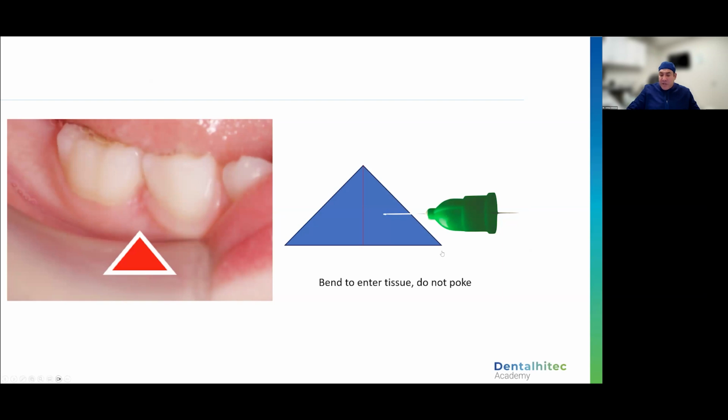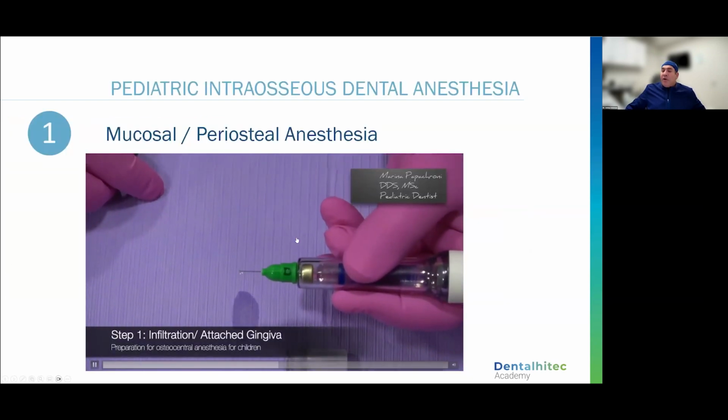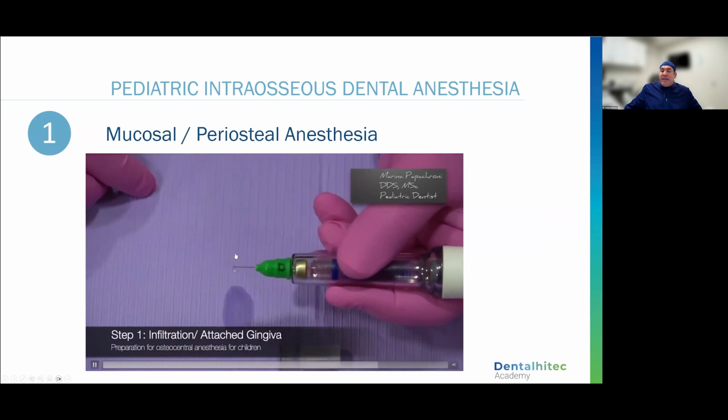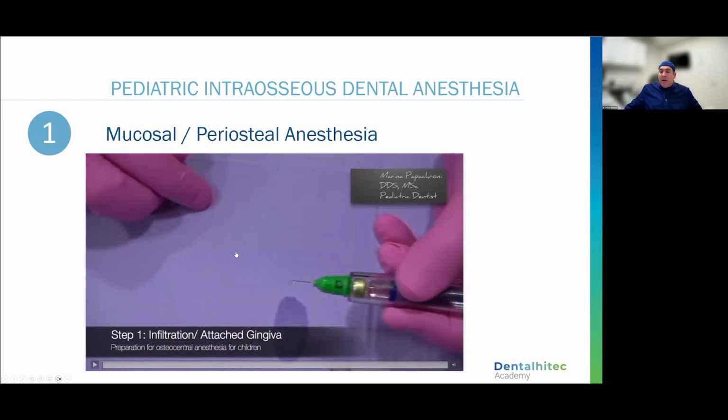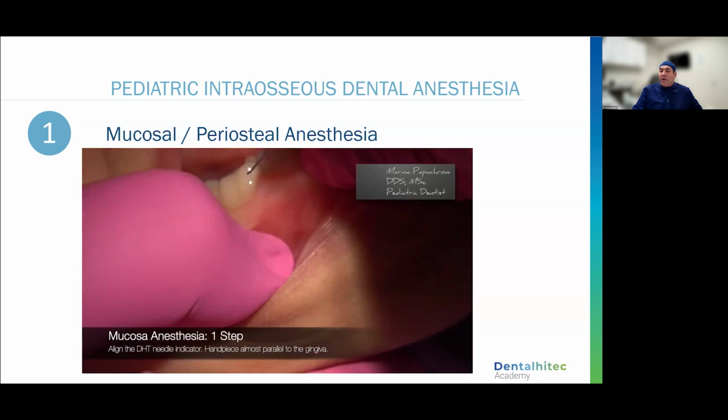In that first stage, and all of you that have these units have already seen this, the reason we use the small foot pedal is because this is just giving drop by drop and it's not speeding up. Some of you have asked, why can't we use the larger pedal for the whole procedure? The reason is that the small pedal delivers slower and does not ramp up your speed as you continue to deliver. This is drop by drop local anesthesia. So that's our very first step.